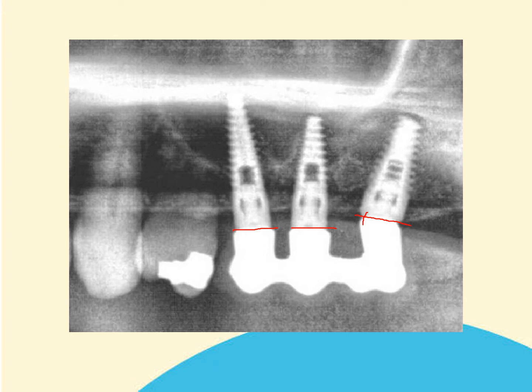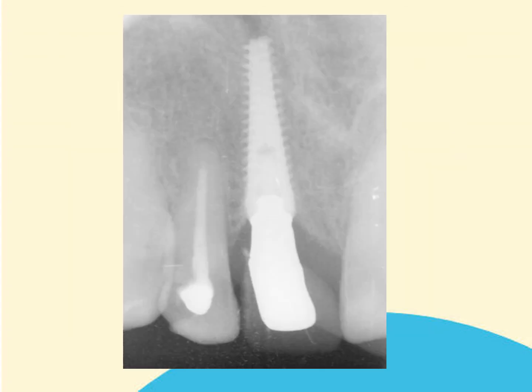In the anchor lock range, the abutment diameter will either be equal or smaller to that of the implant diameter, except in situations where the implant is 3.2 millimeters, in which case the abutment will appear slightly bigger, but there will be a noticeable gap or spacing at the implant abutment interface. The abutment will not appear to fit flush at the implant abutment interface. Again, we have a series 2 type of connection.